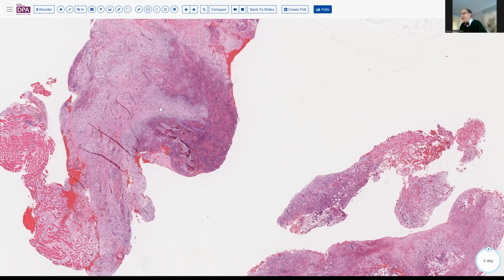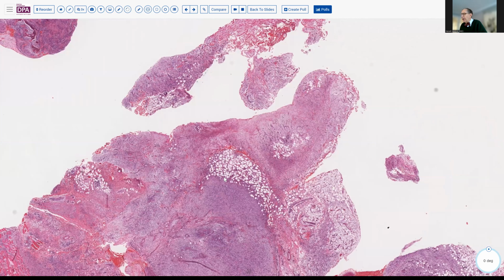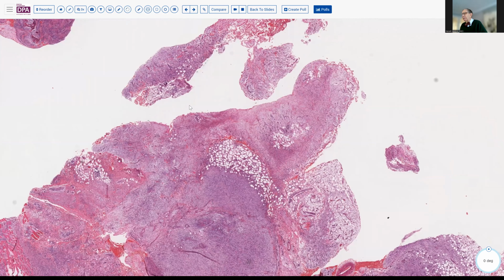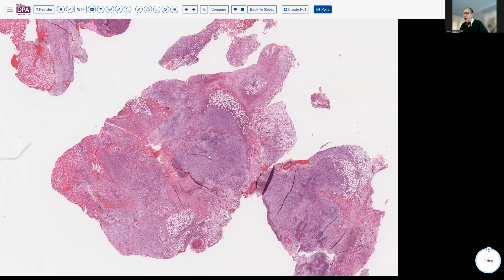this is also a lesion that very often is associated with USP6 fusion gene abnormalities. So it's a benign lesion, certainly not something that's going to metastasize or usually even recur, but it does have this molecular genetic anomaly that it shares with aneurysmal bone cyst. There are also some somewhat similar lesions that occur in the more distal digits that can also have this USP6 rearrangement.